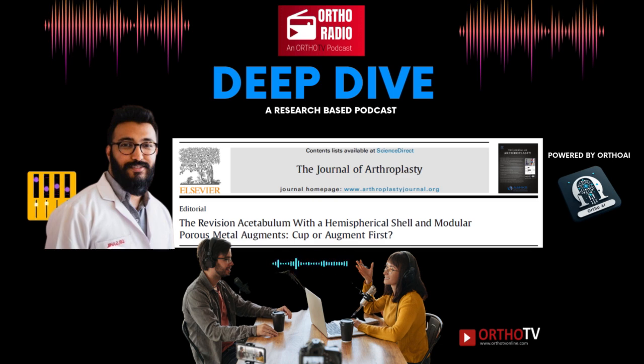Speaking of puzzles, what about those Paprosky type 2C defects? You mentioned those earlier. They involve bone loss in the medial wall of the acetabulum. Like an inward dent. Exactly. How do surgeons deal with that? Well, one option is to use a special concave augment that fits into the defect. So it fills in the dent. Yeah, and creates a level surface.